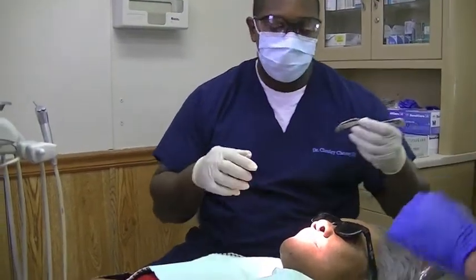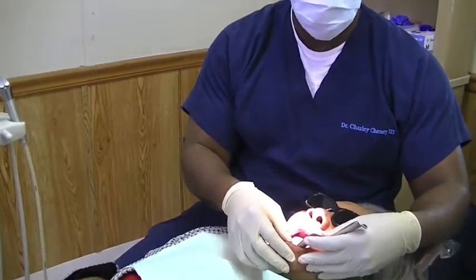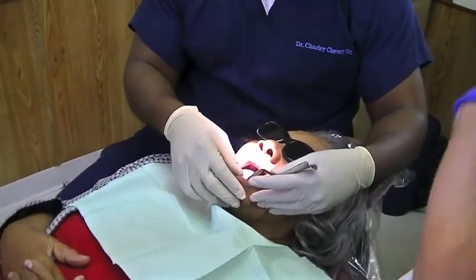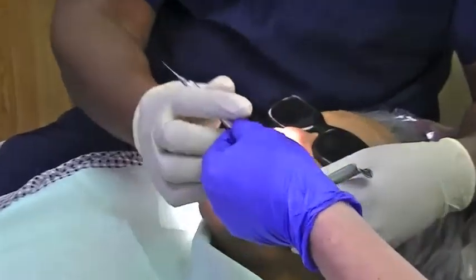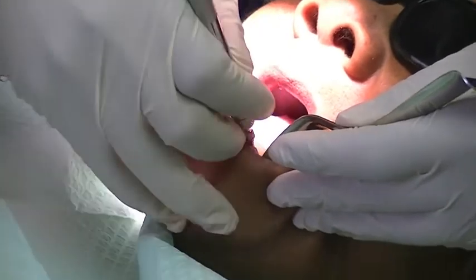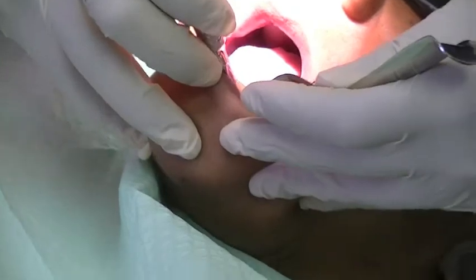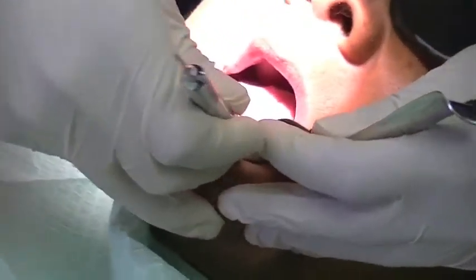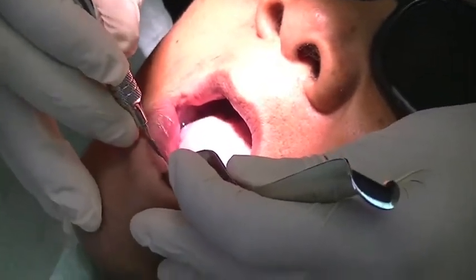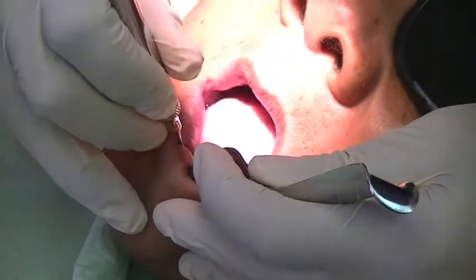I begin by releasing gingiva with a periotome. I will release all the teeth at once, followed by applying the Physics Forceps one at a time.